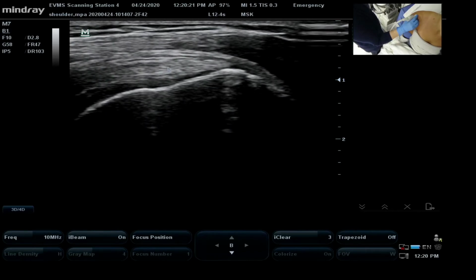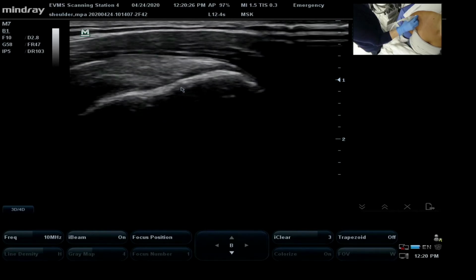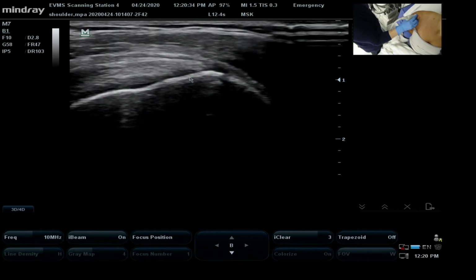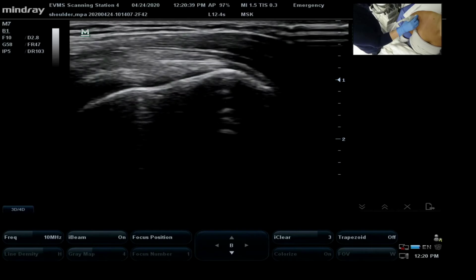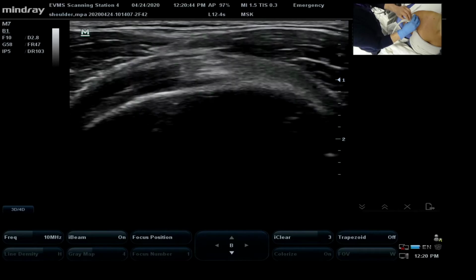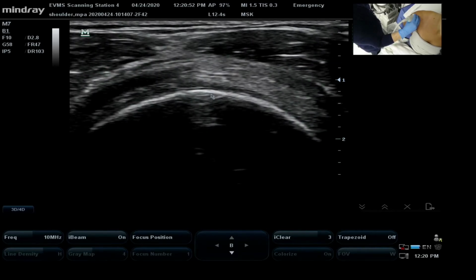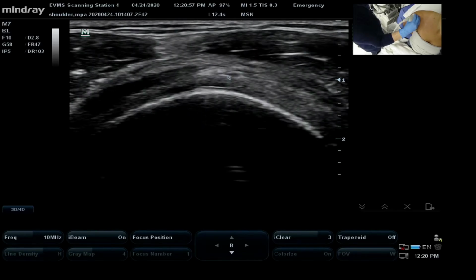Now it's very important to sweep all the way through the supraspinatus, looking for any sort of changes in that nice fibrillar pattern. And what's also important is you want to be able to turn on it into a transverse plane. So you're turning 90 degrees from the position of your probe to stretch out and make it look, sometimes this is described as looking at a tire around a wheel. Because here's our head of the humerus, here's our tendon in transverse.